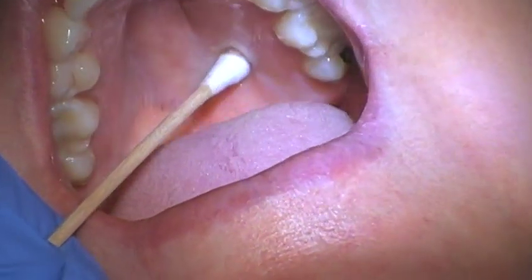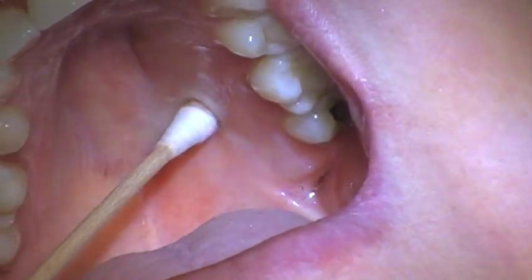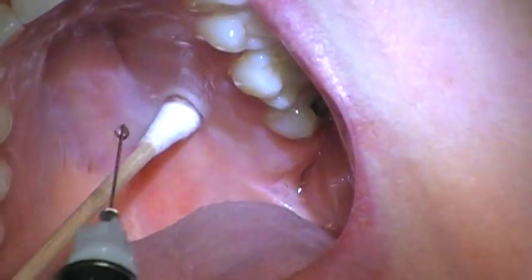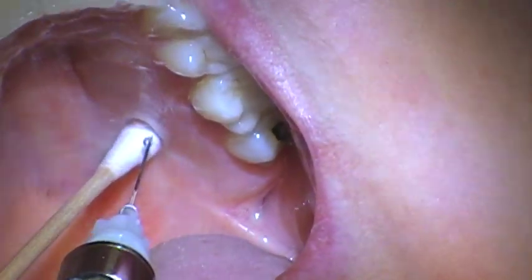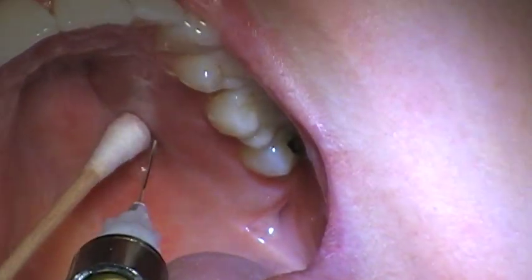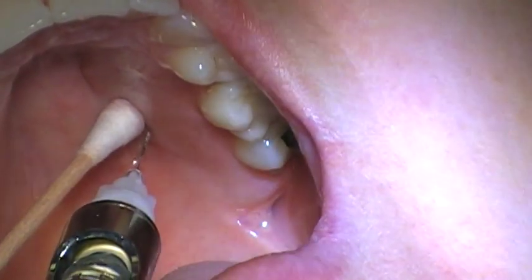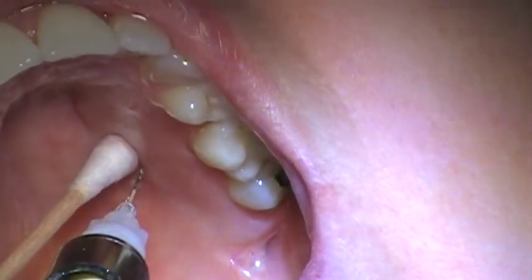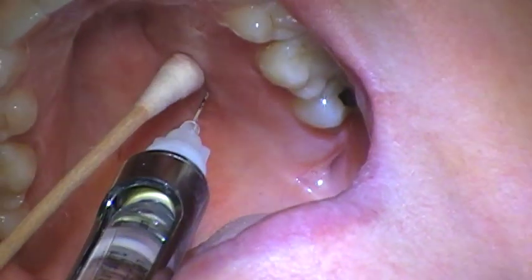I'm doing the pressure anesthesia, pushing pretty hard, and it's been about a minute. I'm going to sneak in — I'm about a centimeter away — then move over and go in where the q-tip was, keeping the pressure. I like to add a little drop, aspirate — it's negative — give a few drops, wait five seconds, and then go in.